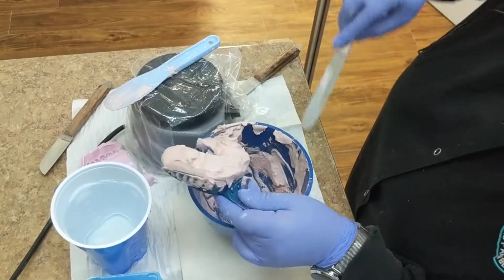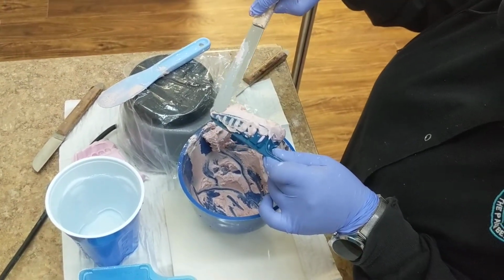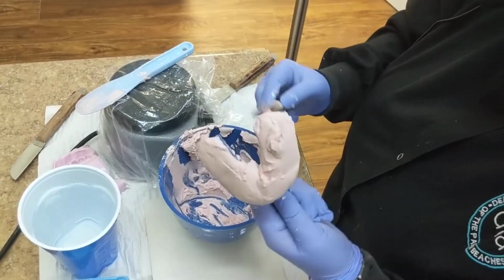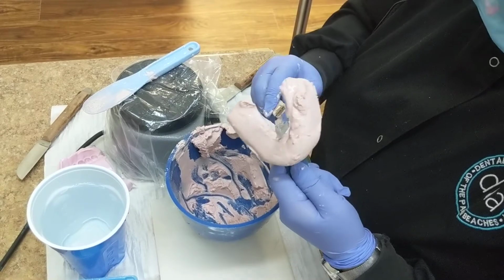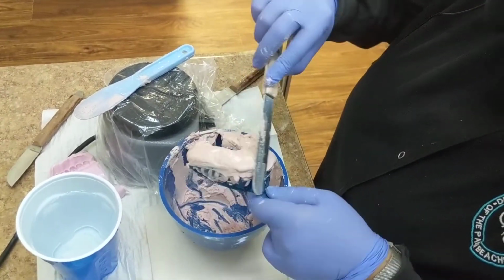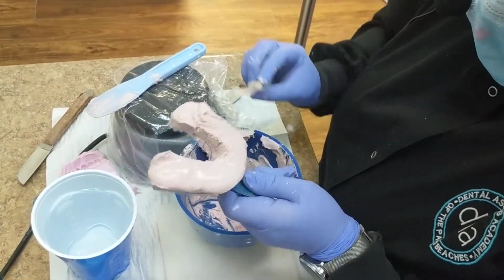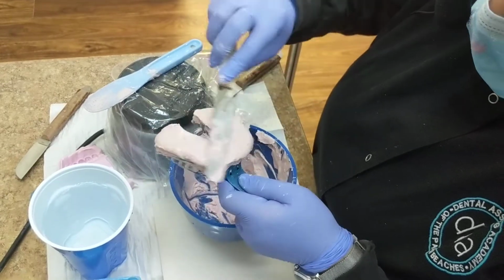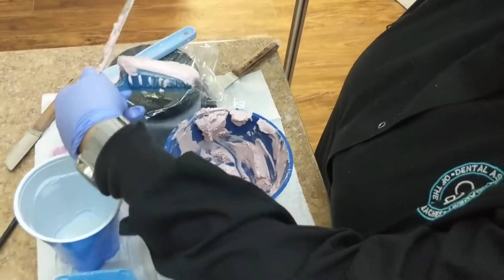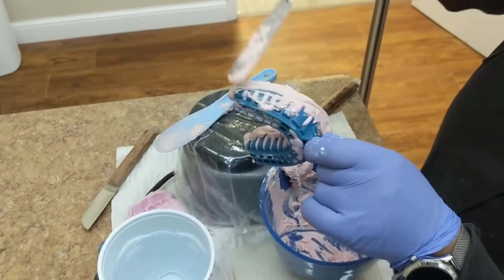And when you do that, you want to make sure you don't have stone going over the tray. You want to be right at that margin of the tray. Because it takes a minimum of 45 minutes for this to start to set. So when it's ready to separate the stone from the tray, it won't lock it. If you have too much over it, it can break and you won't be able to separate it. So I'm just making it a little pretty here. So as I do that, it creates thickness.